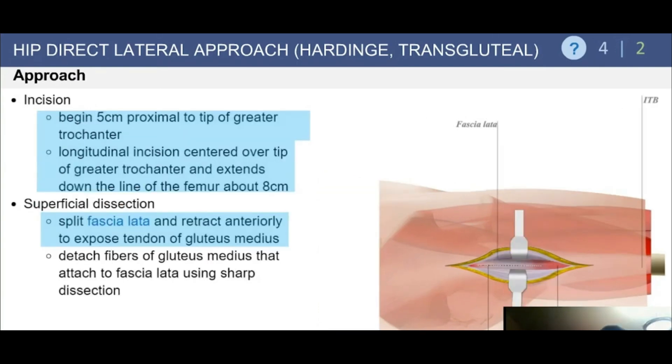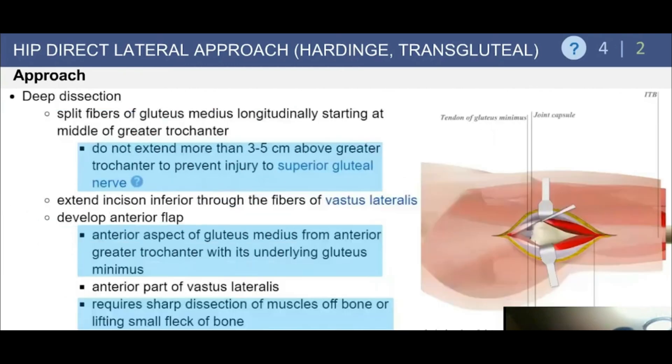Begin the incision five centimeters proximal to the tip of the greater trochanter, centering it over the tip and extending about eight centimeters distally. Once you split the fascia lata and retract anteriorly to expose the tendon of the gluteus medius, you can detach approximately the anterior third of the medius fibers, extending the dissection distally.